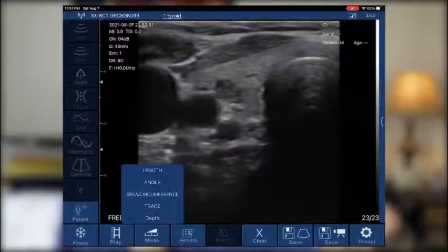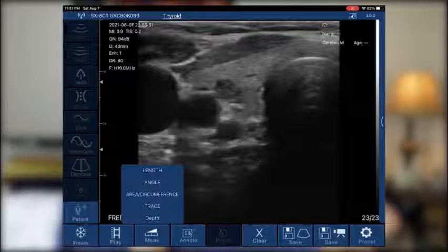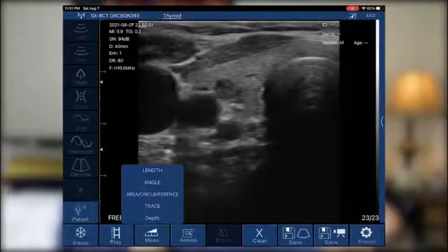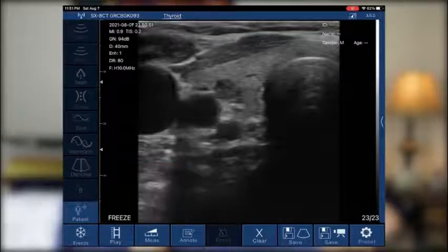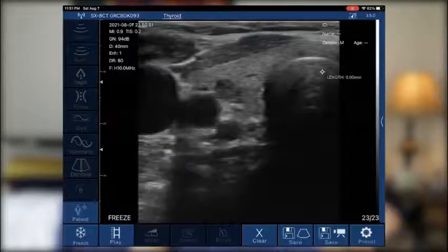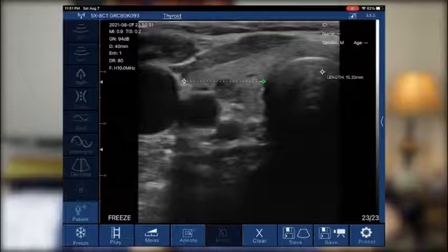So we have five options when it comes to measuring, which is great. It gives us the versatility of measuring the circumference of a mass or the depth from the skin. In this case, we're going to be measuring the width, so we're going to click length. It's really nice because we can simply tap to apply the cursors.